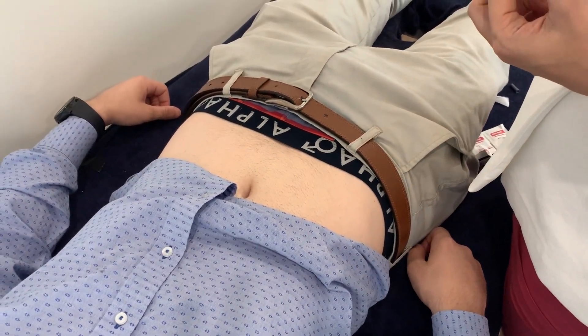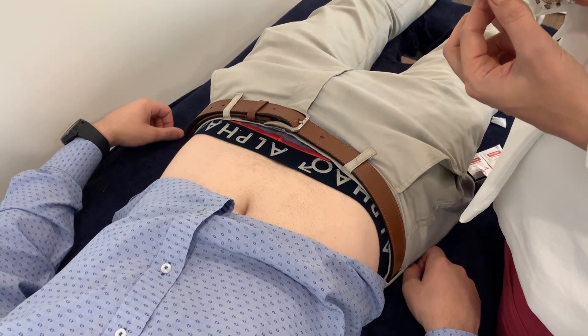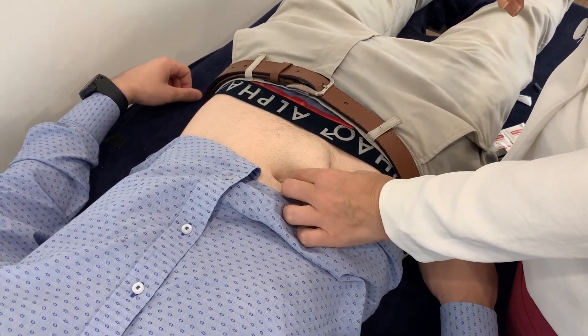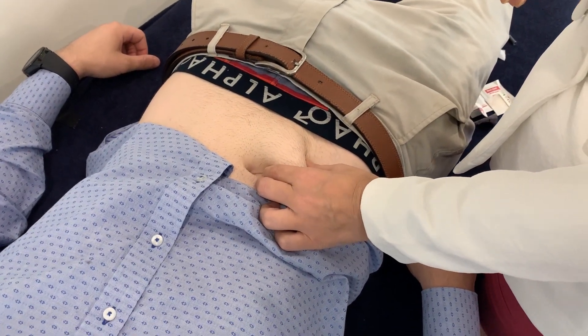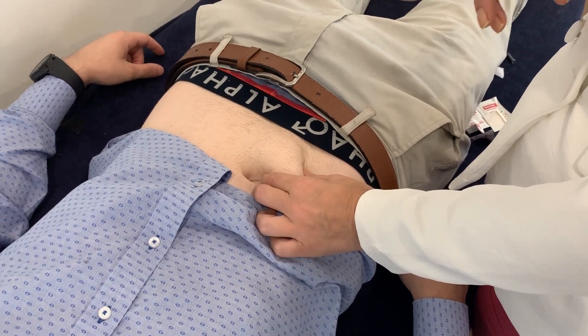This is like watching grass grow, except it's like watching skin dry — not quite the same, a little bit quicker. Then you grab an area of fat like that, really, really firm. You've got to make sure it's firm, otherwise when the needle goes into the skin you get a Mexican wave — the skin runs away from the needle.